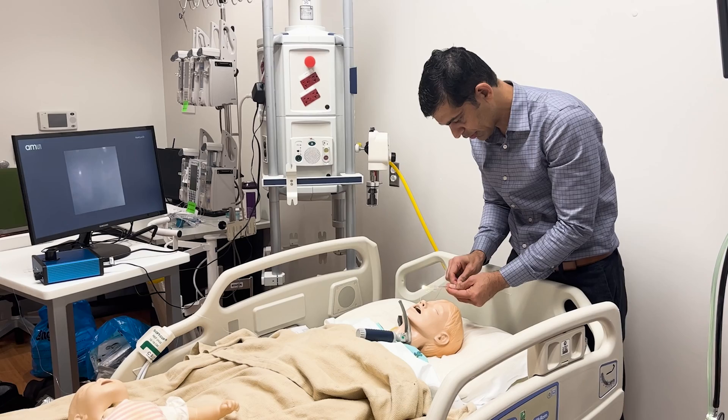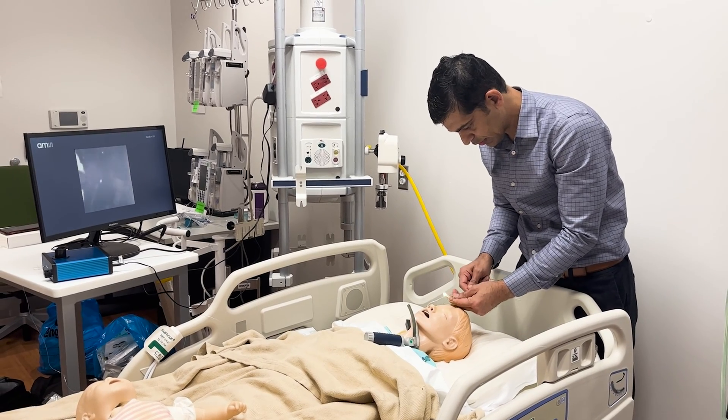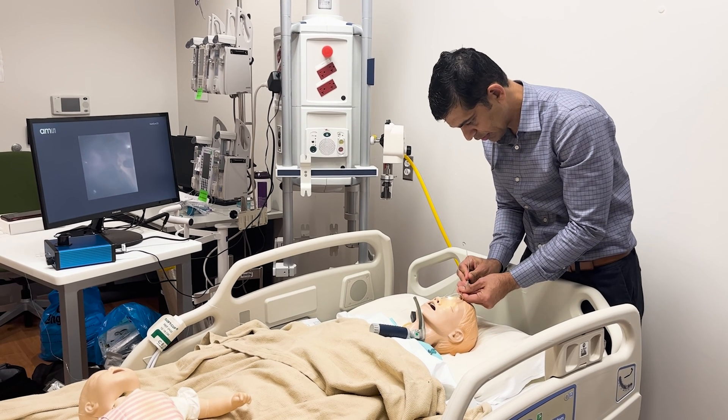The fact that we've got better attachment, better visualization, and it's an overall package that we're producing — combining solving the intubation placement problem with the securing mechanism — makes it a great project.